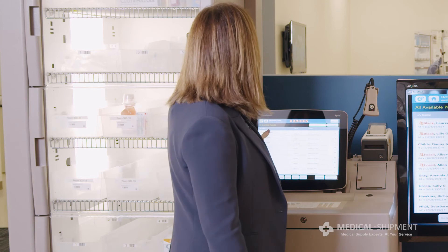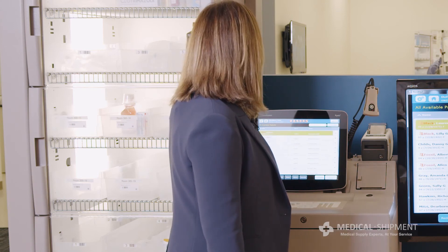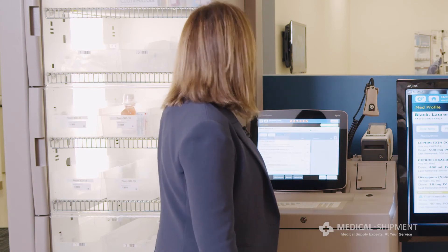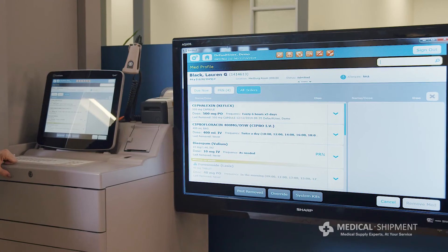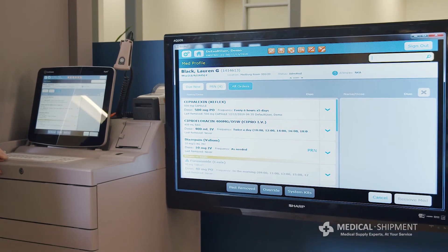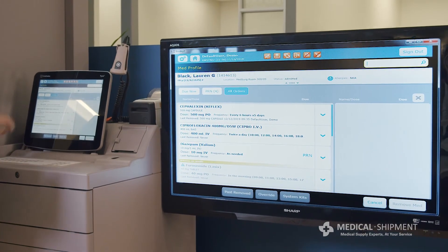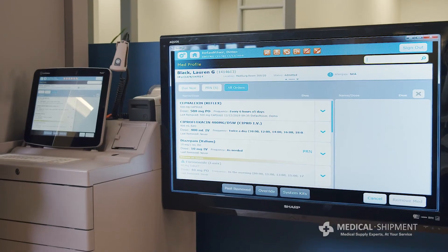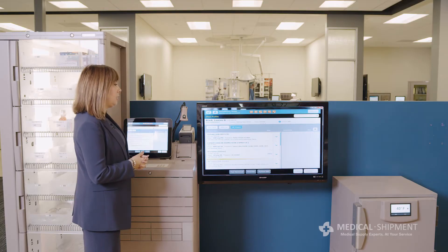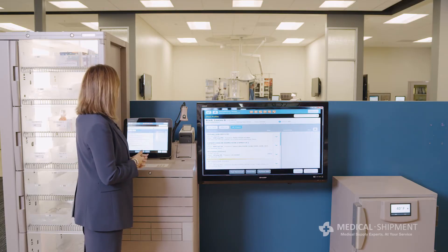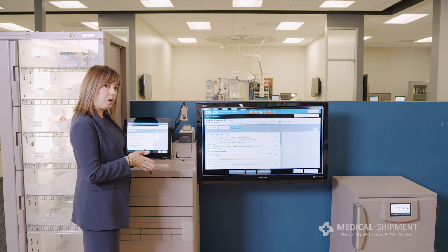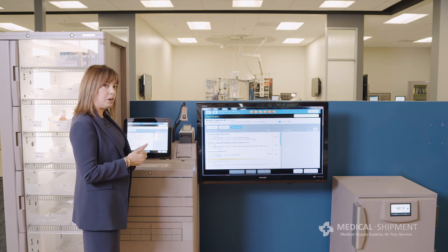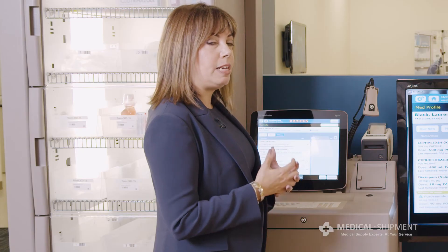I'm going to select Lauren Black as a patient and perform a very simple and straightforward medication removal for Lauren. All of Lauren's meds will come up available to me once I select her name. But I want to review a little bit more information available to me as a nurse so I can gather information that is helpful and relevant in terms of maintaining medication safety and overall quality.